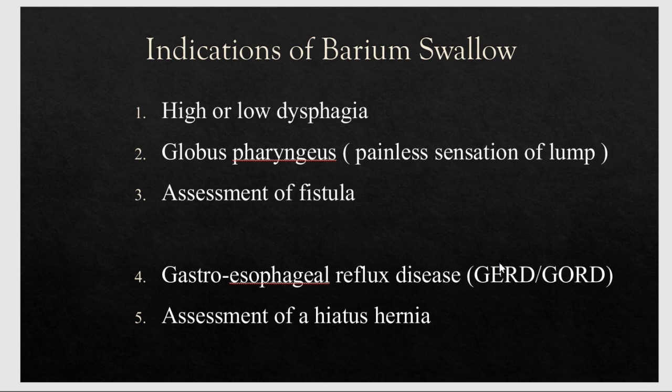As we are talking about the barium swallow, we'll confine ourselves to the study of the oral cavity, the esophagus, and the upper part of the stomach, that is the fundus of the stomach, because the swallow is for the oral cavity up to the fundus of the stomach, right? The third is if the patient is suffering. The fourth one is if the patient is suffering from gastroesophageal reflux disease, also known as GERD or GORD. In that case also, this barium swallow can help us.